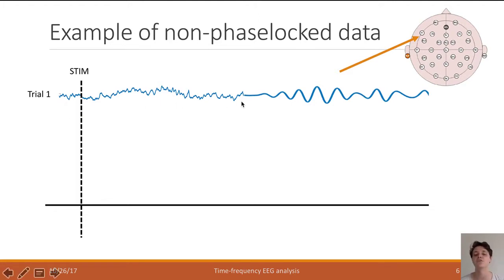And the EEG data, just as Carlijn already told you, is basically a recording of a population of neurons. And this population of neurons you can find under the respective side. So this is on the left side of the brain, the left frontal side with the F7 electrode. And you see here's the stimulus presentation, and then there's normal brain data, and then after a while, halfway through the trial, this enormous wave comes up, which probably conveys some information. Why? Because it's very pronounced.